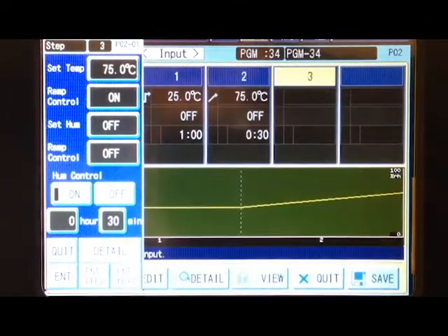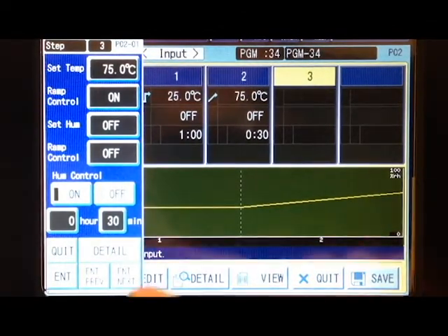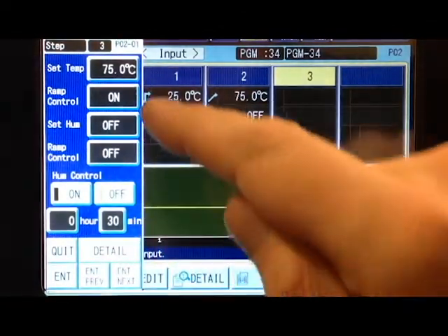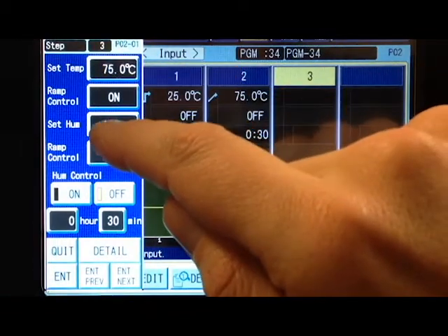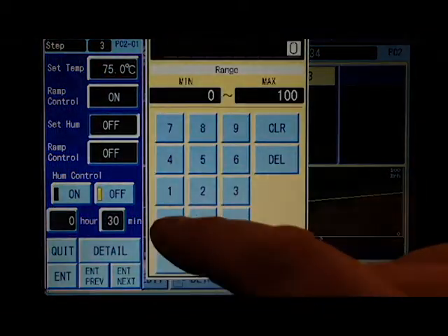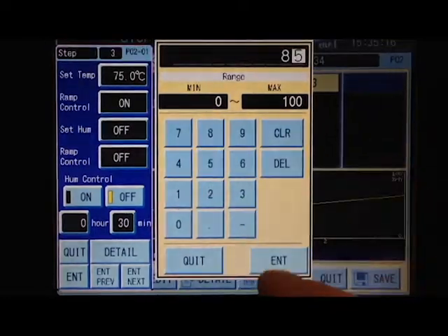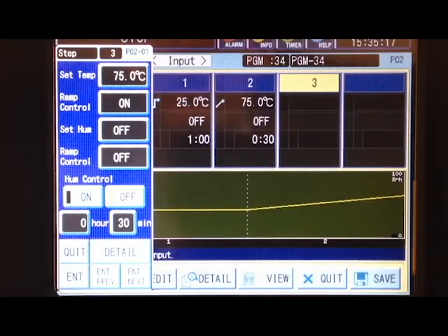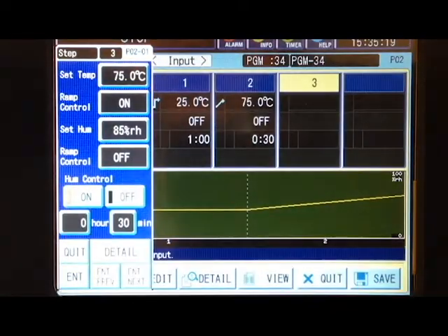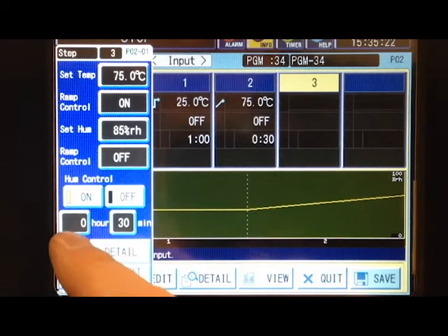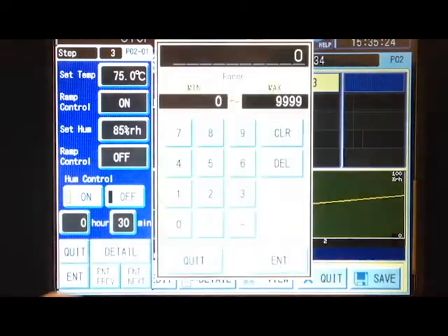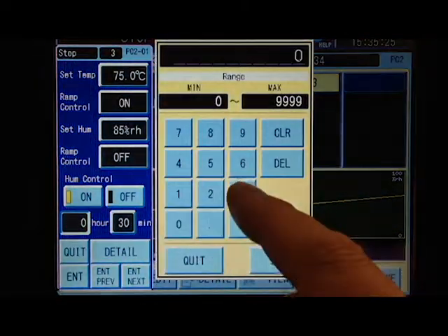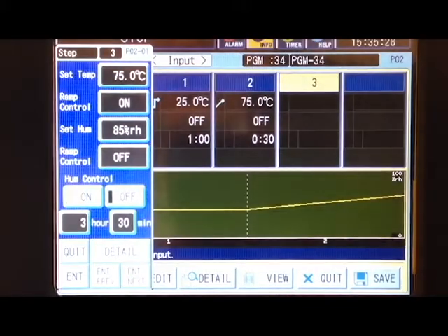Now let's create a humidity step. We'll leave the temperature at 75 and set the humidity to 85. Let's enable humidity and have that soak for three hours and 30 minutes. That's fine.